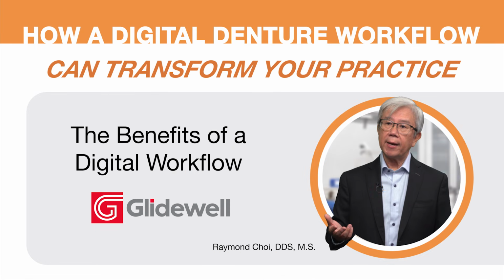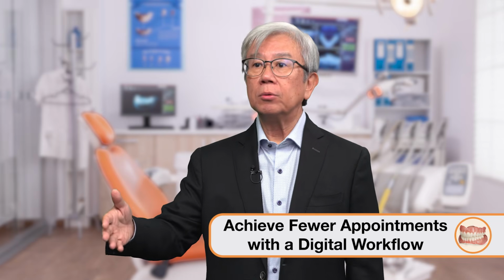Someone that comes in, a patient that comes in with existing dentures, you can take a wash impression, take a digital bite scan, and digitize the whole data, and actually skip the process where normally we would get a custom tray, a final impression, and then the longest visit probably, when we have to do the vertical dimension, aesthetic parameters, and centric record. That whole visit could be skipped using that workflow. And you can go directly to the wax try-in or the 3D printed try-in. So it'll save at least a visit or two. So that's huge, I think, for general dentists.